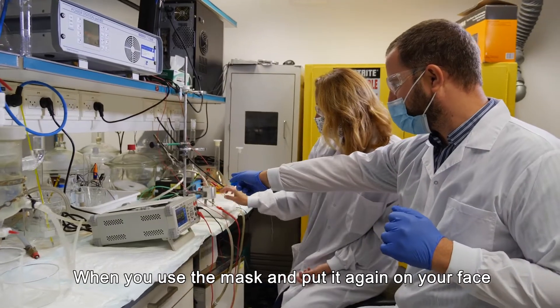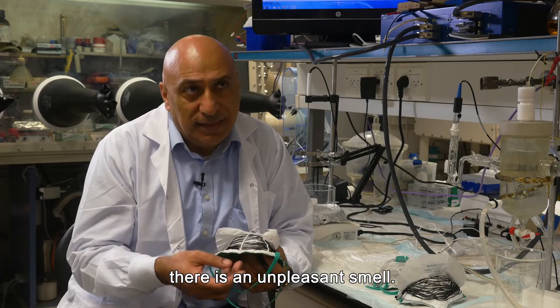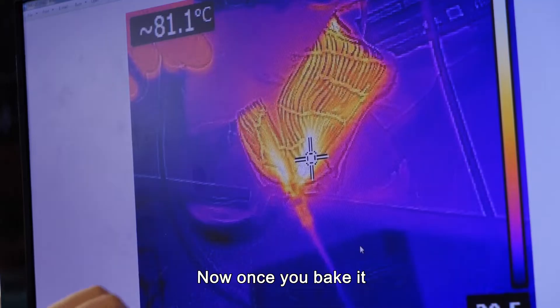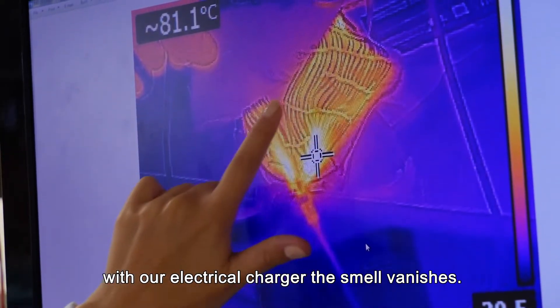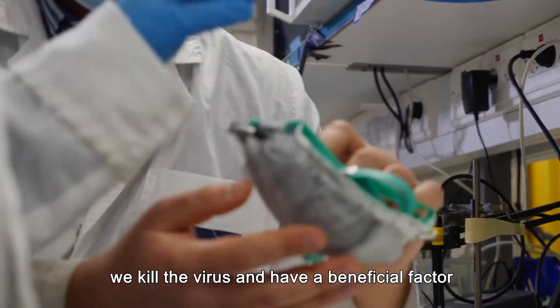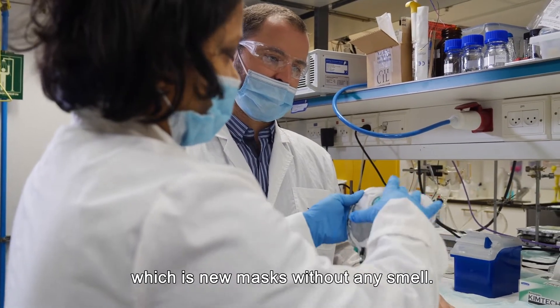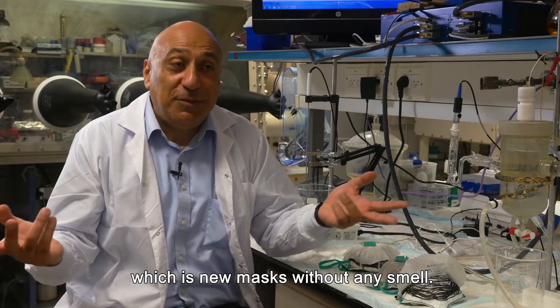When you're using the mask and you put it on your face again, there is an unpleasant smell — this is the smell of our breath. Now once you bake it with our electrical charger, the smell vanishes. So we kill the germs, we kill the virus, and we have a beneficial factor: a new mask without any smell.